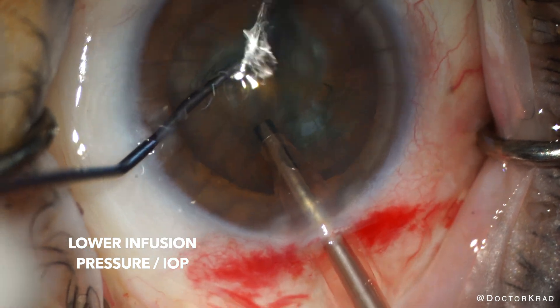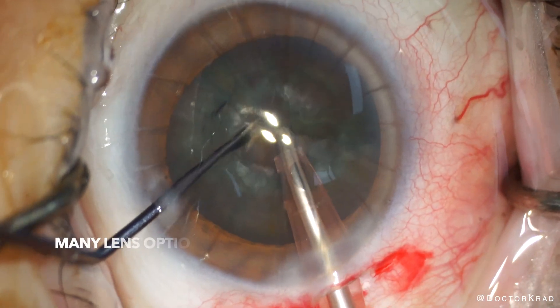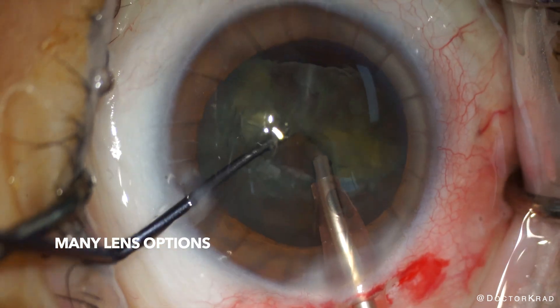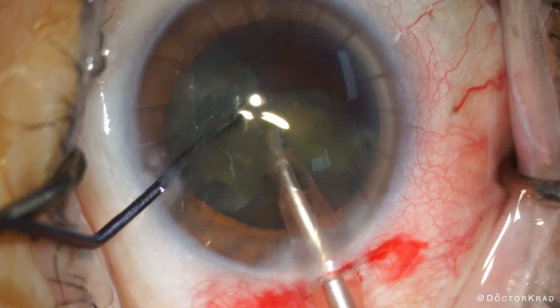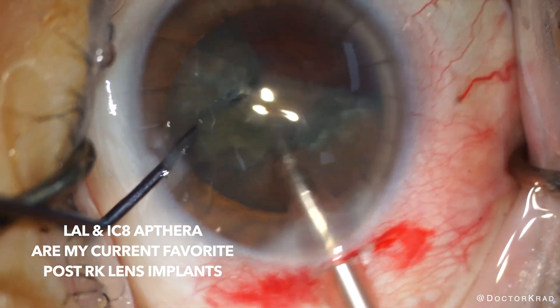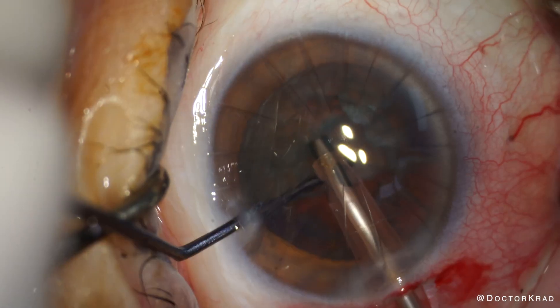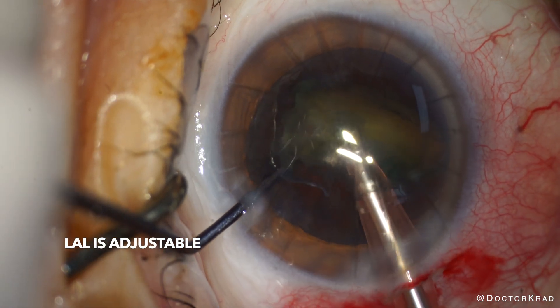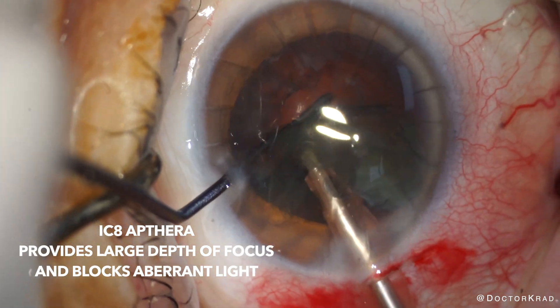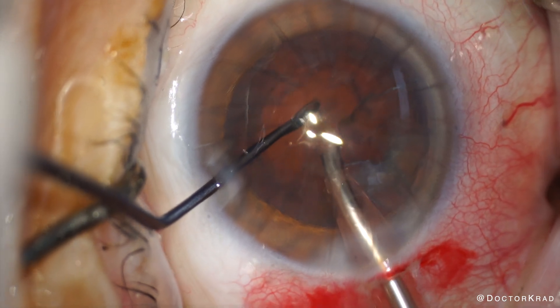Next I'm just going to remove the lens material and then polish the capsular bag in preparation for the lens implant. As you know, there are many lens options for patients. My favorite lenses for RK patients are the light adjustable lens and IC8 Apthera. Given the higher possibility of refractive surprises, these lenses are forgiving. With the light adjustable lens, you can adjust the prescription of the lens implant after the eye has finished healing. With the Apthera, you have a large depth of focus and aberrant light is filtered out, helping improve vision quality. Neither of these lenses are perfect though.